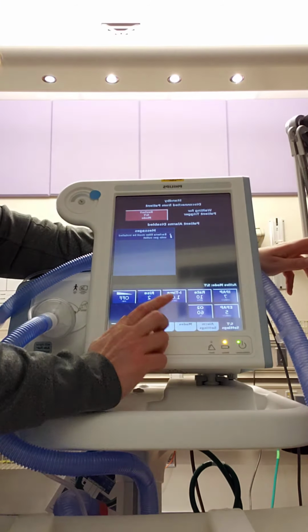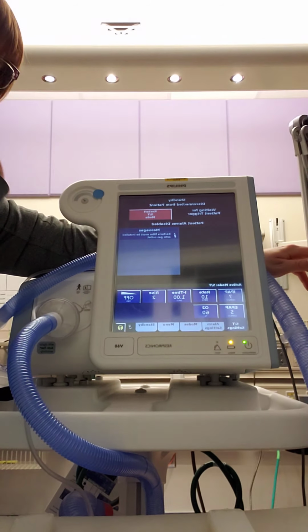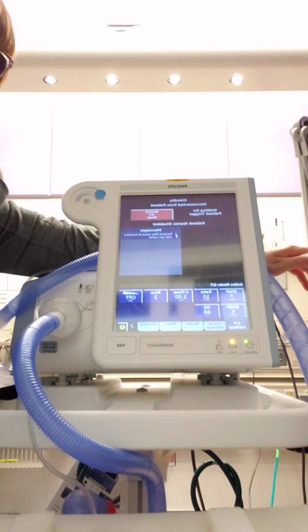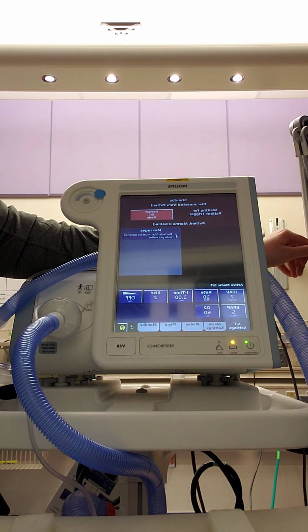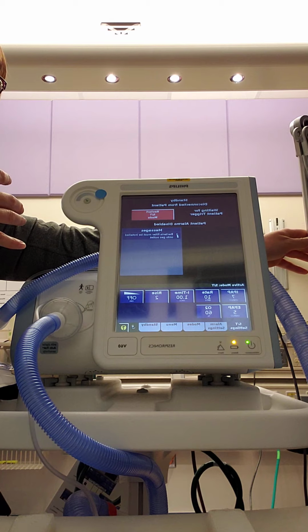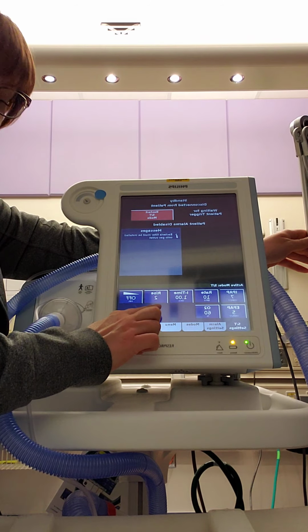That's how they relate. So she's going to stick her head out the window for the same amount of time, whether it be 1 second, second and a half, 0.78 seconds. But the rise is how much flow we are using to deliver that breath. So again, that's how fast I'm going in the car with her.